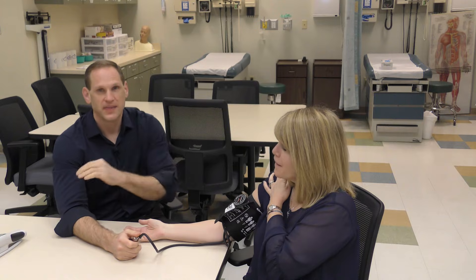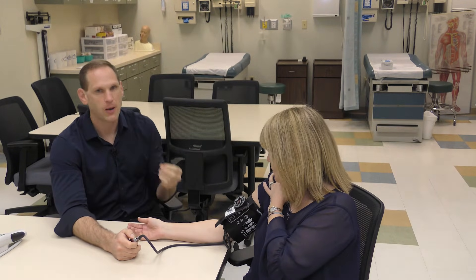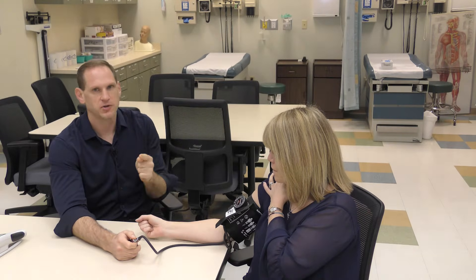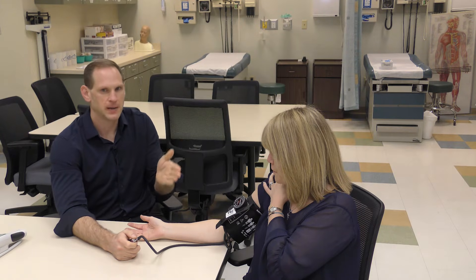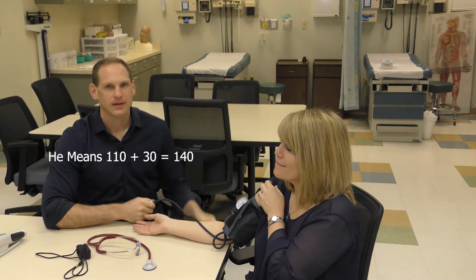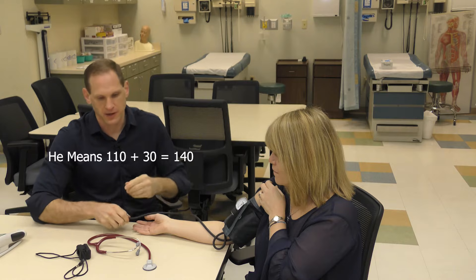The number where you start feeling the pulse again is the palpated pressure, and it represents the systolic pressure. In her case that number was 110, so we're going to pump up to 130 when we actually take the blood pressure reading. Now that we've done the palpated pressure, we're ready to do the auscultated pressure.